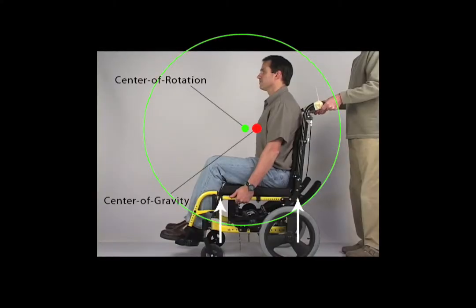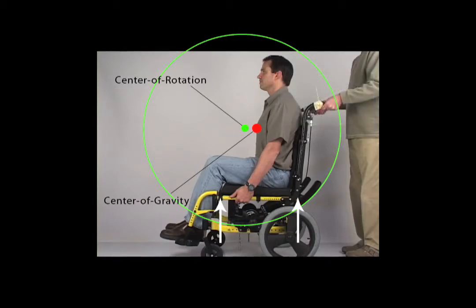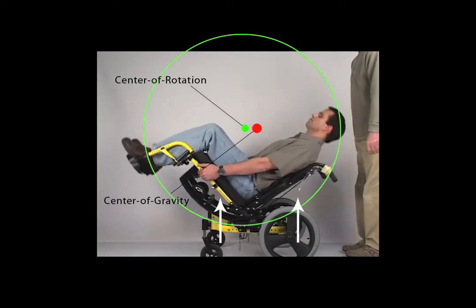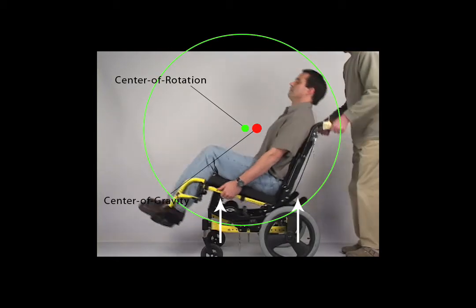First, let's discuss the adjustment of center of gravity and center of rotation. In this example, the tilt mechanisms have been disabled, so the system is free to rotate. We will also maintain the seating setup. The position of the backrest relative to the footrest will not change. In the first example, the center of gravity is behind the center of rotation. As a result, when support is left on the chair, it falls automatically into the most tilted or rotated position.